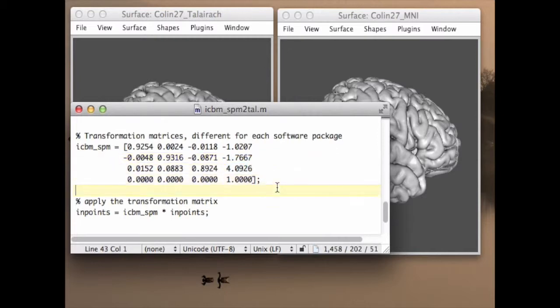So within a single study, you can choose one subject and use it as a reference brain, or a template, and find the transform that best aligns each subject to it. You could choose the subject that would require the smallest transforms for the other subjects to match to it, or you could create a template by finding the average brain. Those methods would work fine with a single study, but it would be very difficult to compare your results to other studies since there's no guarantee that your reference brain would line up with others. This is a significant problem because it makes each neuroimaging study stand on its own. It hinders meta-analysis and data mining in the field until a better reference system is developed.